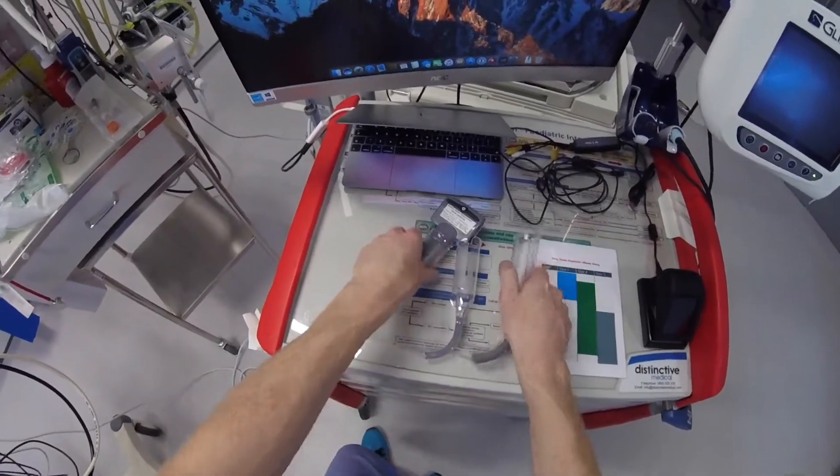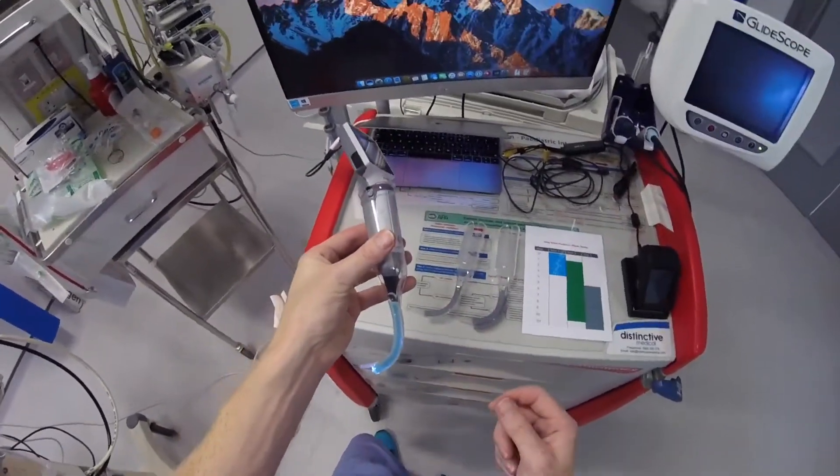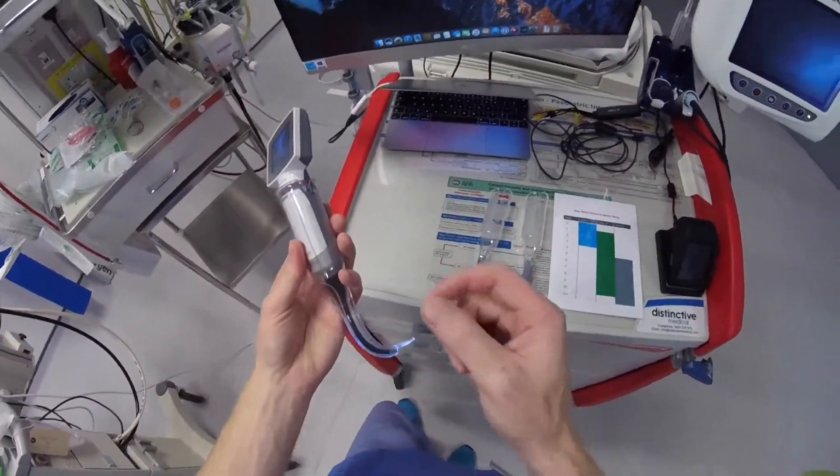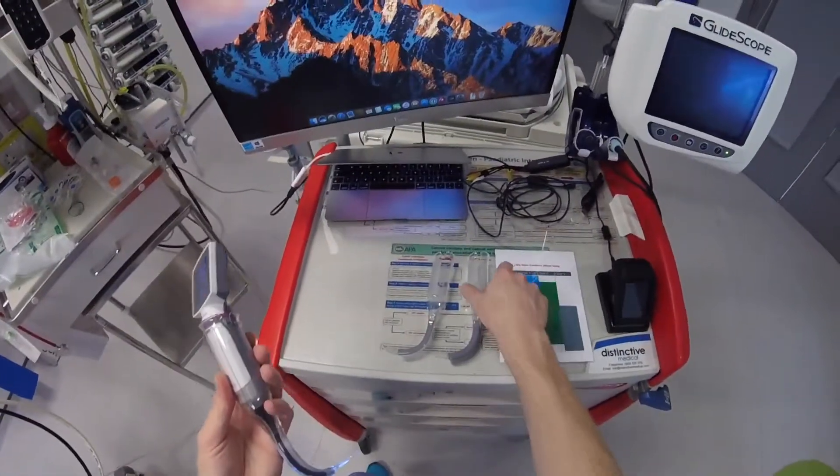The reason for that is you've got a hyper-angulated video laryngoscope, so you need some way to help you get the tube to the cords. Either you need a styletted tube, or you need a channel.